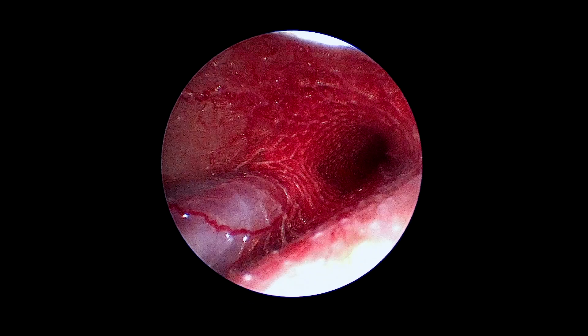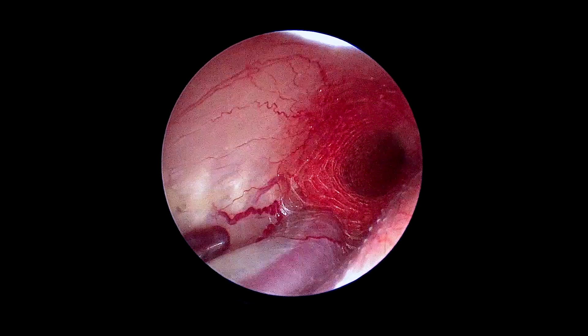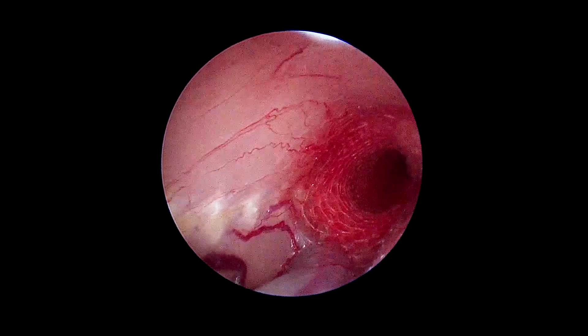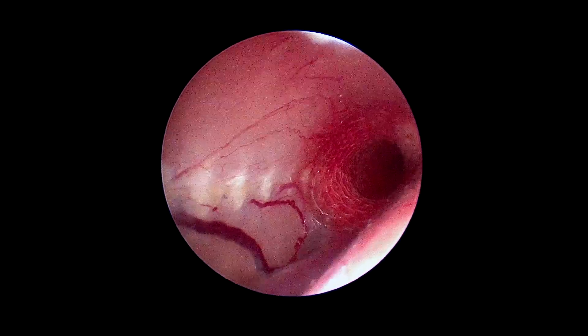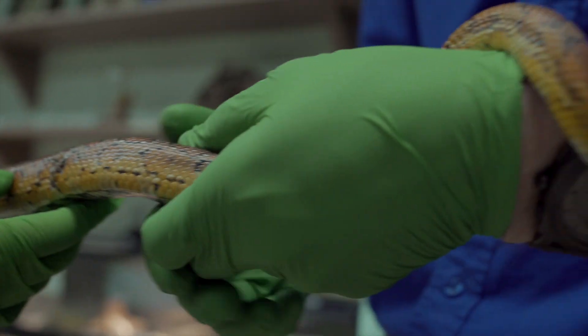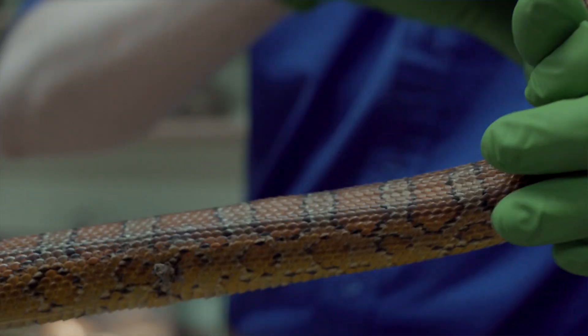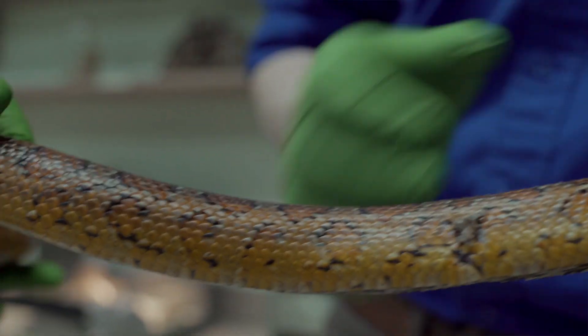This is just some retained shed because she just shed — stuck on the suture material. Checking on that, making sure it looks healthy and clean. Since she's been on the antibiotics, her respiratory issues have cleared up, so it seems like she's in the clear at the moment.